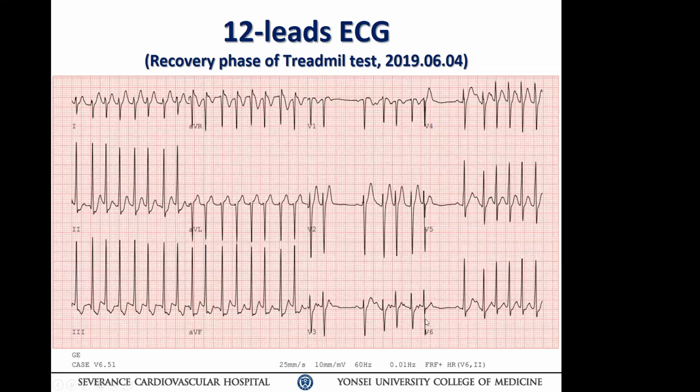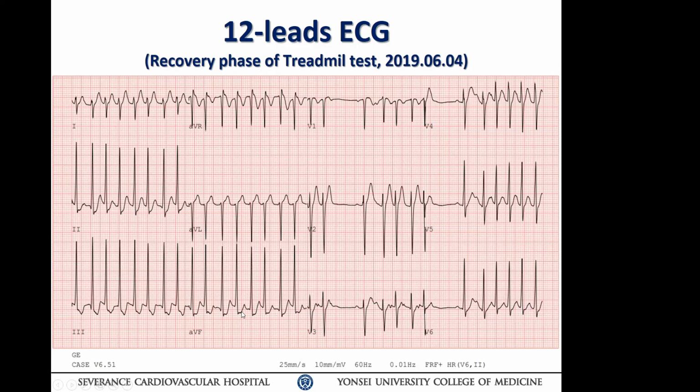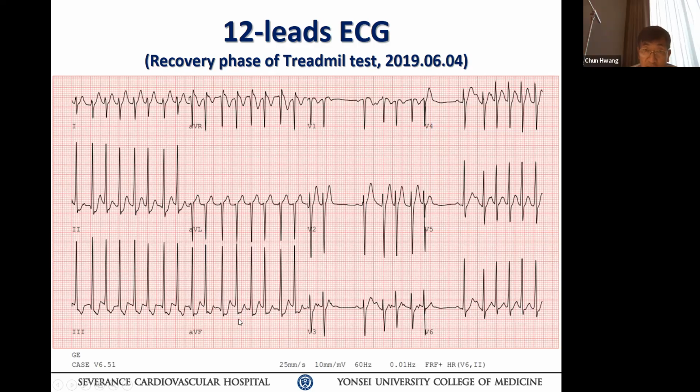근데 재밌는 게 뭐냐면은 그 다음 run 하는 tachycardia 봐봐. 거기는 P wave가 아까 우리가 조금 전에 본 것 같이 안 보이잖아. PAC만 보이고. 그지? 네, 맞습니다. 그러니까 this patient definitely, that's a confirmation that he has 2 different mechanisms of tachycardia. Okay? That much I can tell you.